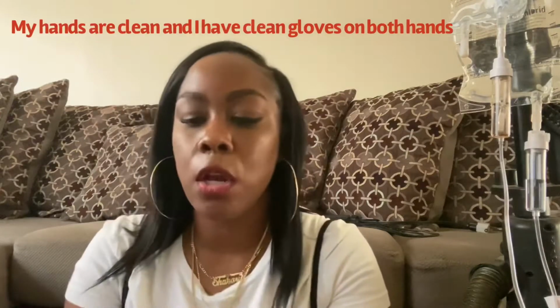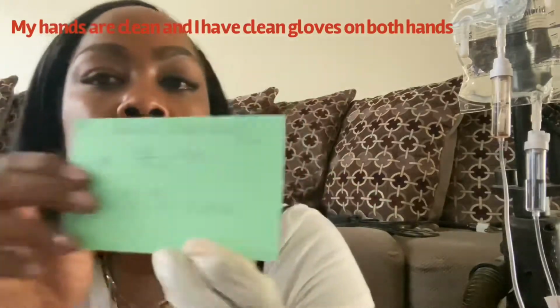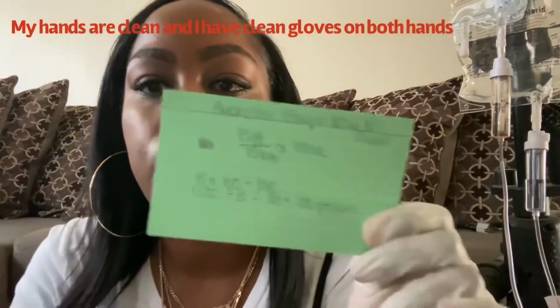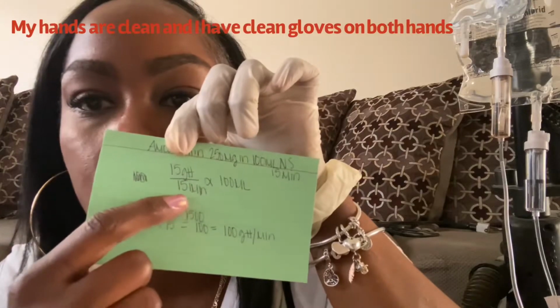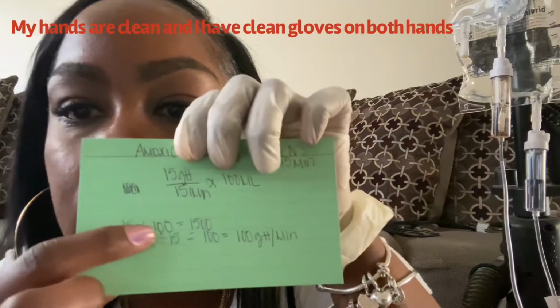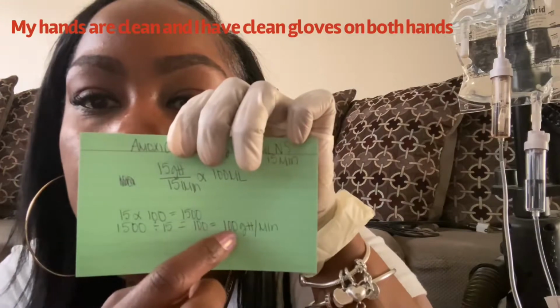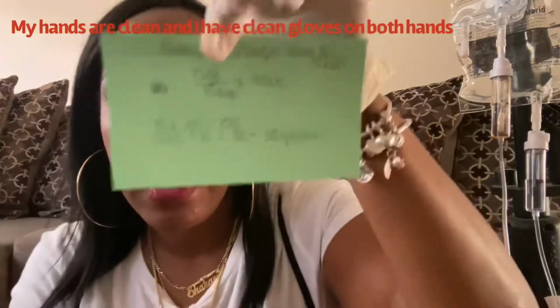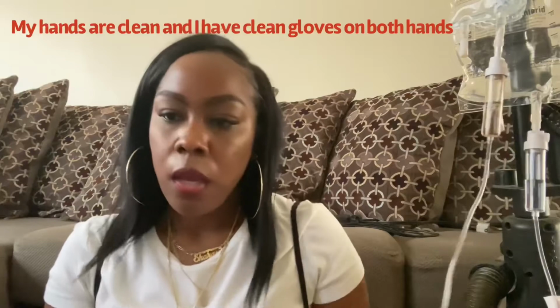My calculations are right here. The amoxicillin is 250 milligrams and 100 mLs of normal saline to be given over 15 minutes. So I did the 15 GTT over 15 minutes times 100 mLs. 15 times 100 is 1500. 1500 divided by 15 is 100. So 100 GTT per minute. Okay, I have that right there. So of course I did my calculation.